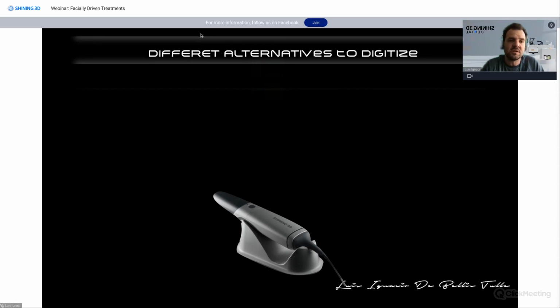You can deactivate or disable the artificial intelligence, and if you put some tracking points on the face of the patient, you will be able to make a decent facial scan. It's going to take you some time. Maybe the patient is going to get bored, and as you know, the main problem of all these protocols now is that the patient has to remain static. They have to force their smile. And maybe with this option, it's going to get a little bit tough to do it.